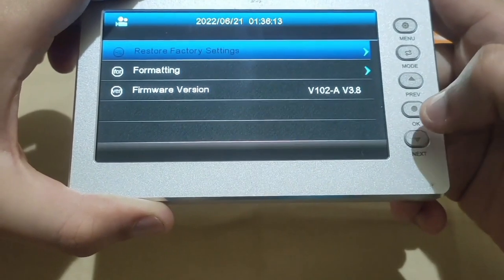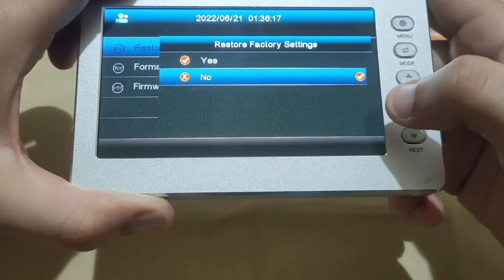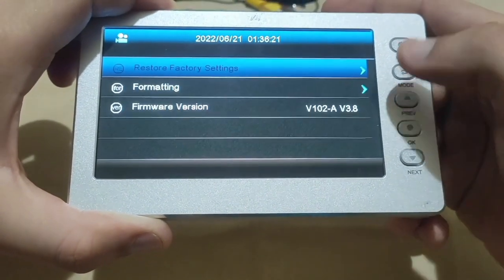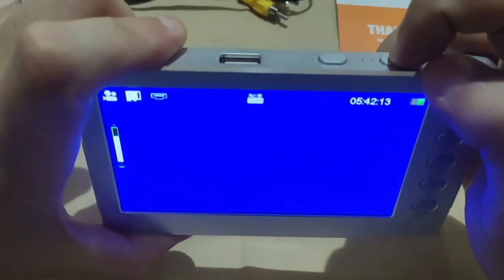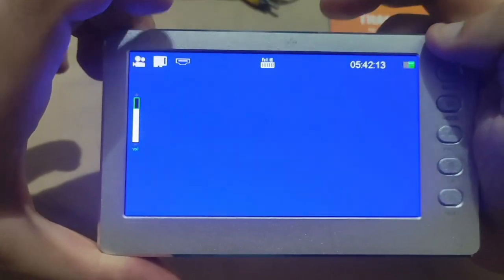You can restore the settings to the factory default state by choosing Restore Factory Setting and pressing Yes. To adjust the volume, press on Volume Up button to increase the volume, and press on the Volume Down button to decrease the volume.